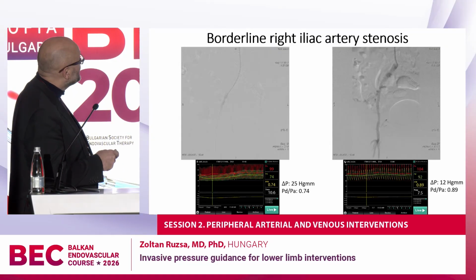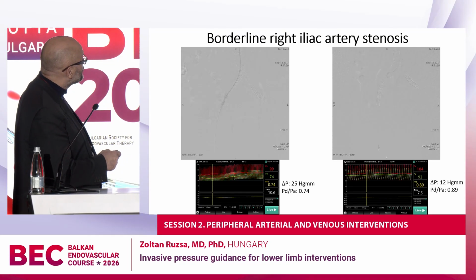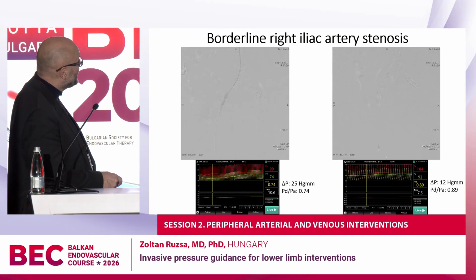So this was the lesion in the right iliac, which was. Can you push this? It's not working.